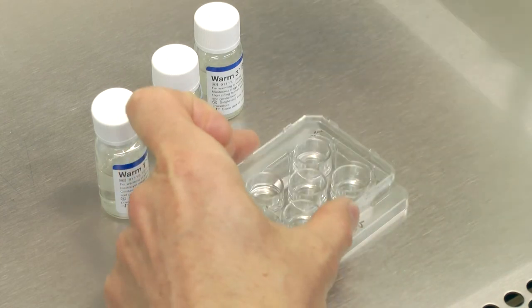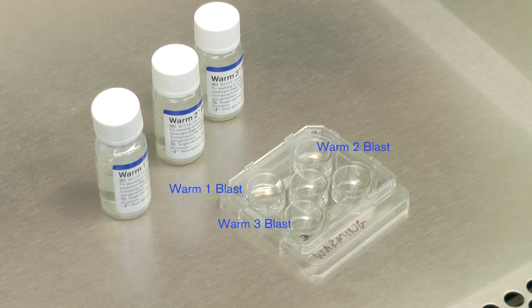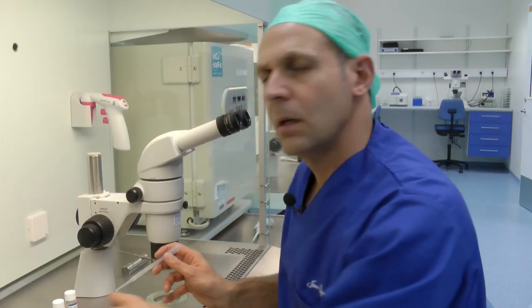Do not heat up your warming solutions in a CO2 incubator. Once you've identified the correct patient for warming, move the cryocane containing the RapidStraw into the smart box.